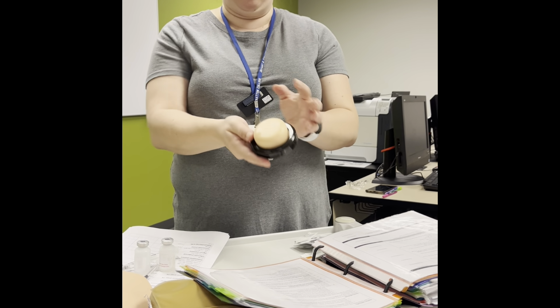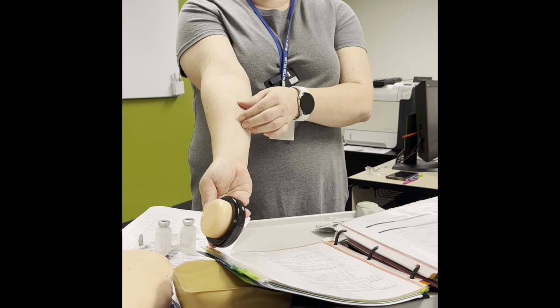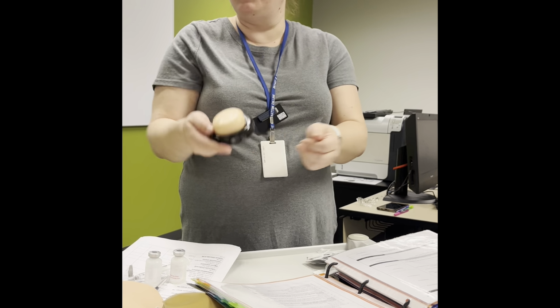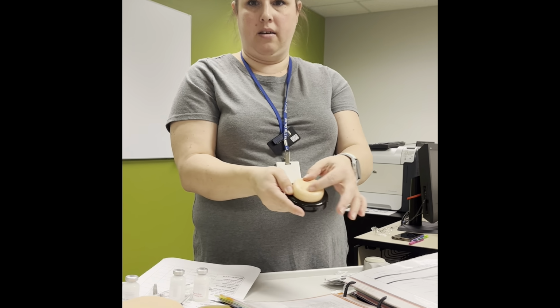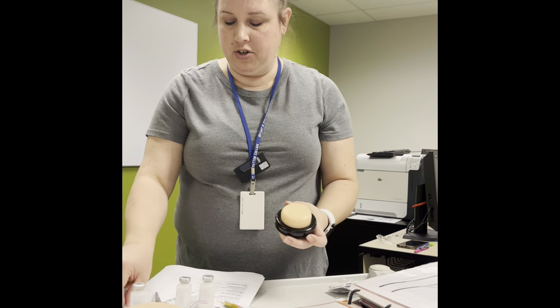I don't want you to pull. In real life, we would pull the skin down because if you feel your forearm, it's a little squishy because our skin needs to move. We would pull it taut so we could create more surface tension to put the needle in. I don't want your fingers on the pad doing that. So just tell me that you would pull it tight. I'm gonna inject first.